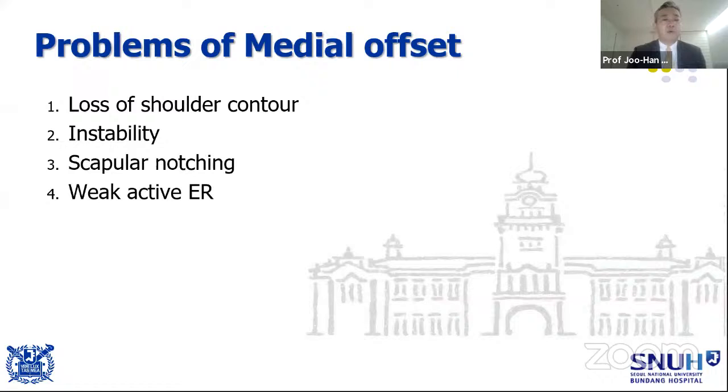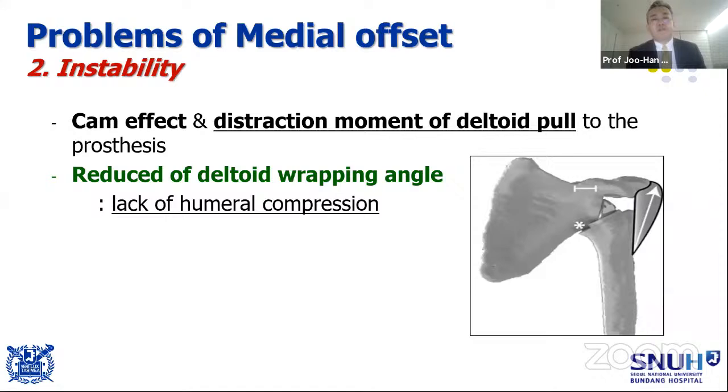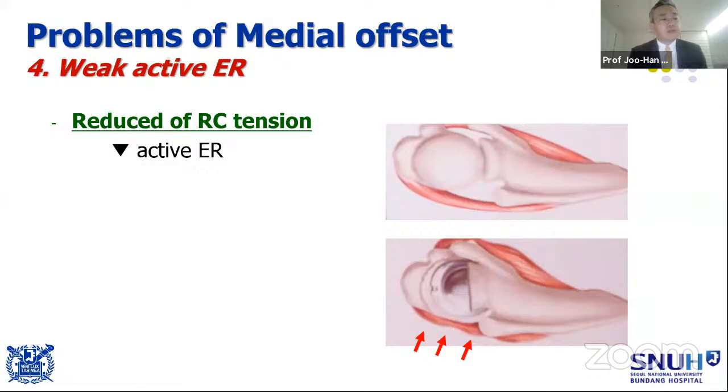But as you know, there are several problems with medial offset. Number one, the loss of shoulder contour. Even really old ladies are still concerned about this loss of shoulder contour. And also this deltoid pull, the distraction moment of the deltoid, causes some instability, or causes more adduction scapular notching, or reduces the remaining cuff, causing weakness of active external rotation.